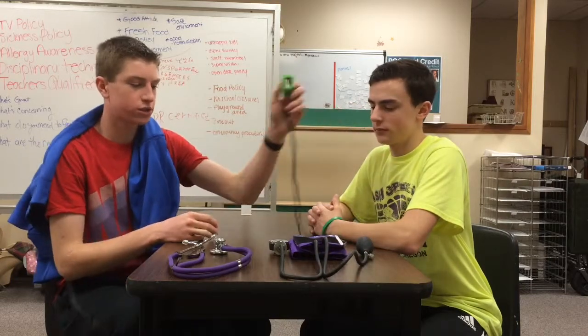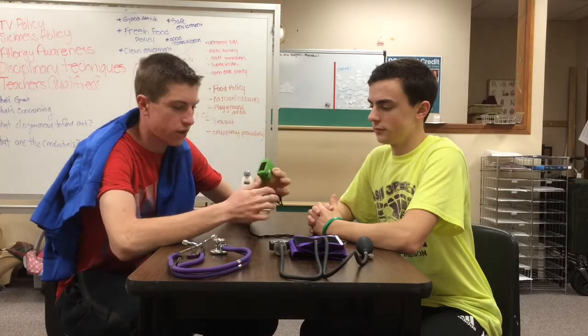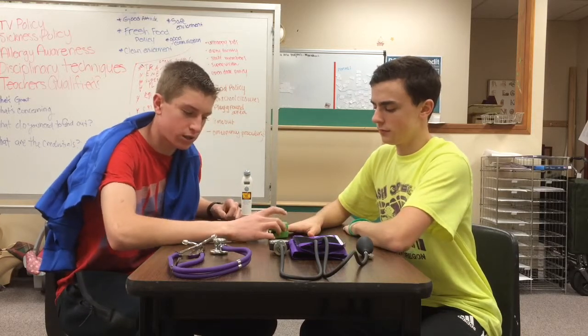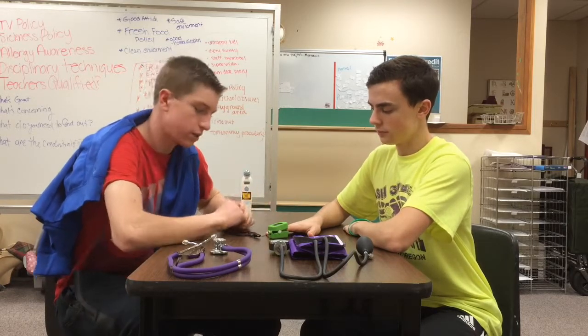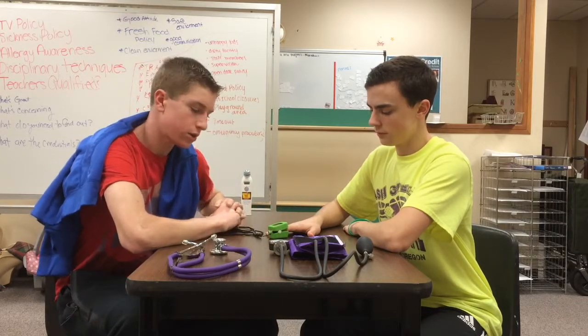In this video, we're going to learn how to take oxygen saturation levels. First, you need an oximeter here, and then once you have one, you place the patient's index finger into the oximeter and press the button on top. Then you wait a few seconds until some numbers pop up, and it will tell you what the level is. For Garrett here, it's 99, and then normal is around 90 to 100.